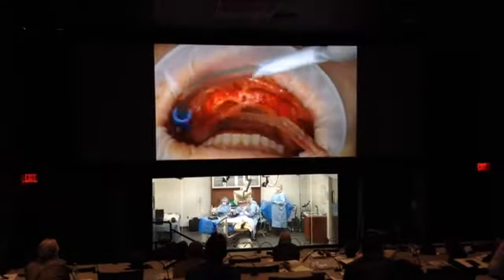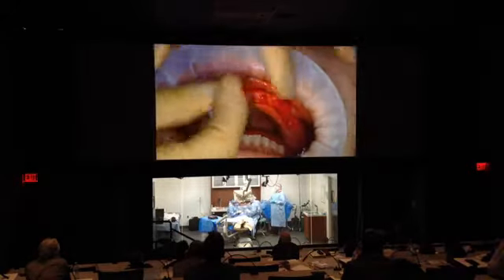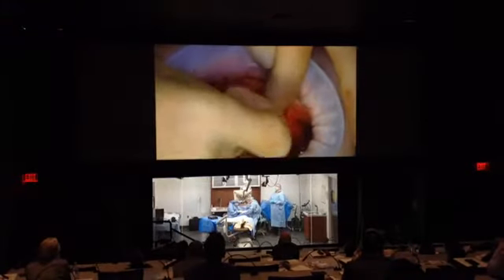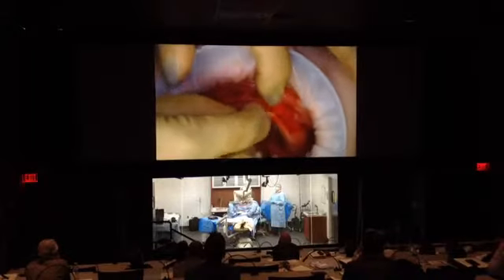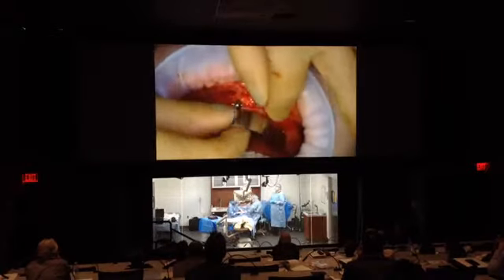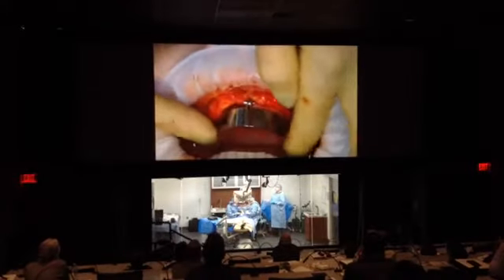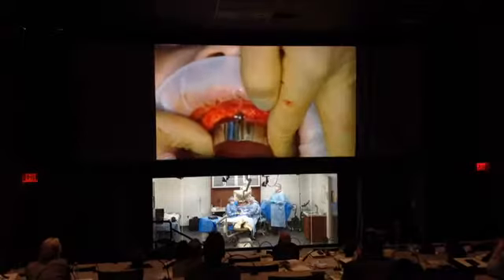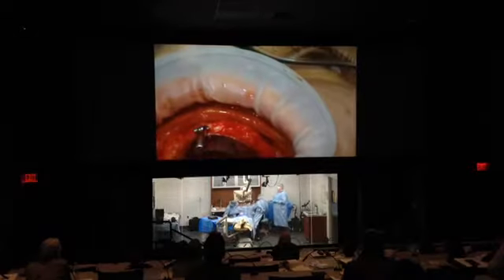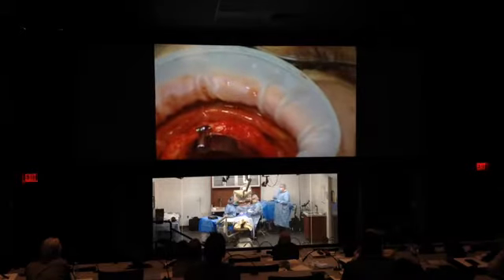Okay. Let's put the All-on-4 guide there. And I'm going to open a little. You're getting a little bit sleepy. Okay. Here we are. This is the All-on-4 guide. The other thing that it does, you can actually pinch the guide, and it could also hold the palatal flap away from the ridge so that I could see better. Perfect. Okay, we can get a good view on that.